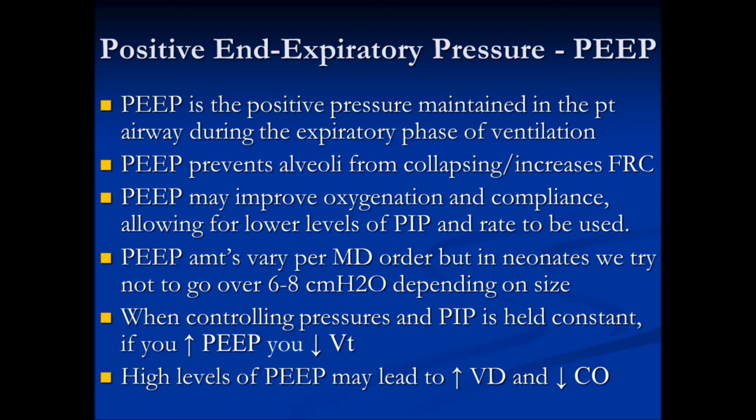Even when we talked about BiPAP, you learn this concept, because if you increase your EPAP, but you don't increase your IPAP when you're using BiPAP, you decrease your tidal volume. So again, hopefully this is a review for you. Those of you who are finding this information new, that's concerning. It should not be new information to you.